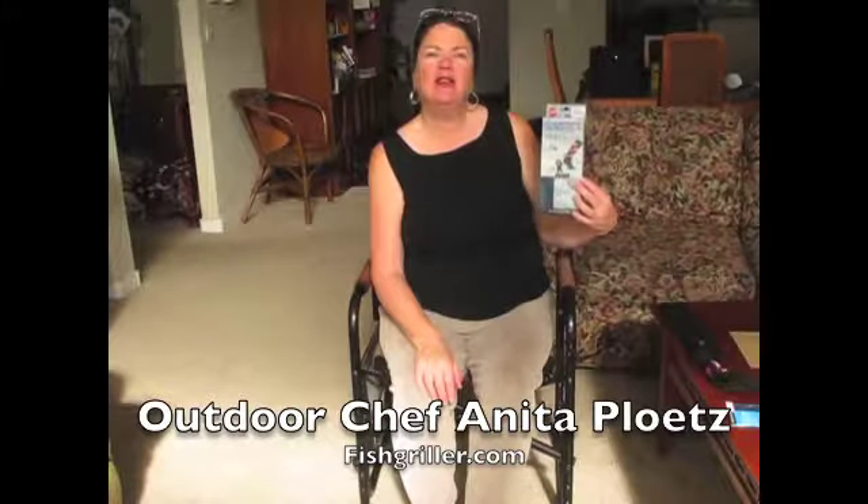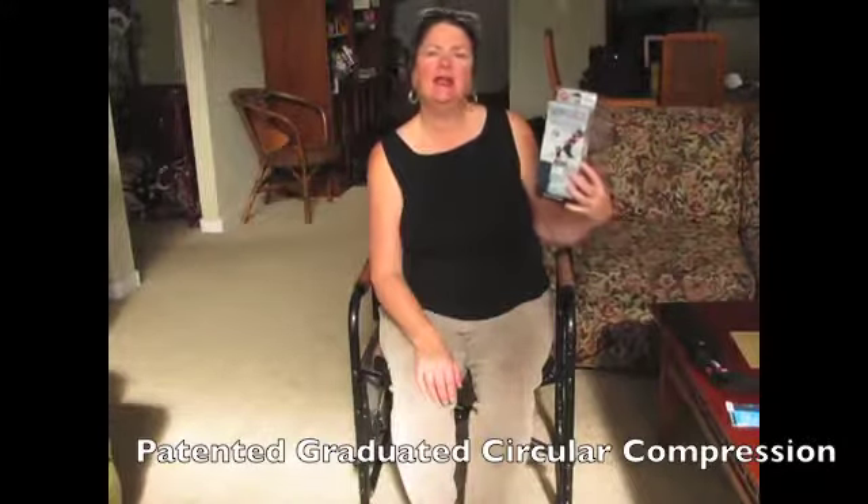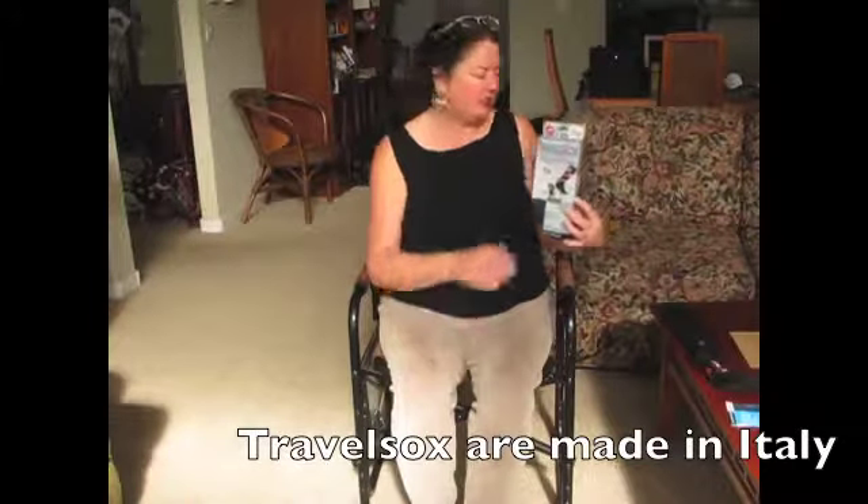Travel socks. Have you ever thought about using compression socks when you're traveling? These are made in Italy. They're easy to put on, easy to maintain, and they do help with circulation.